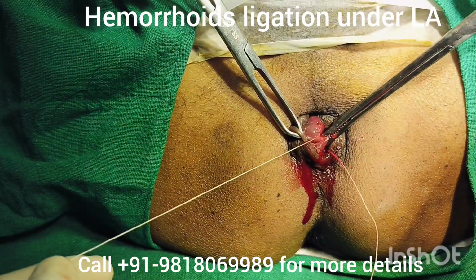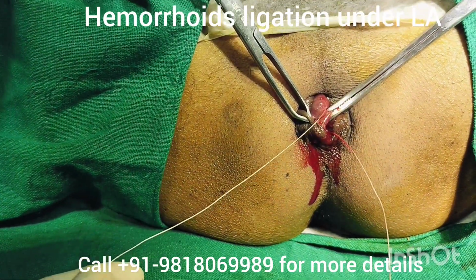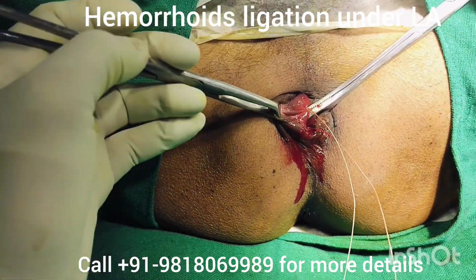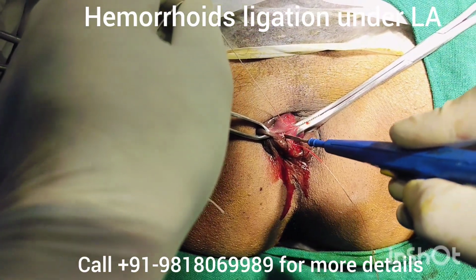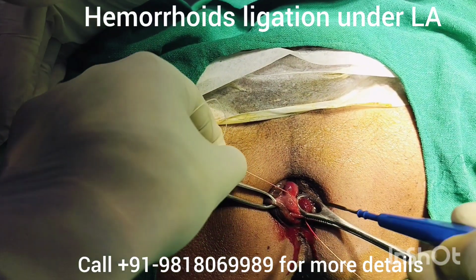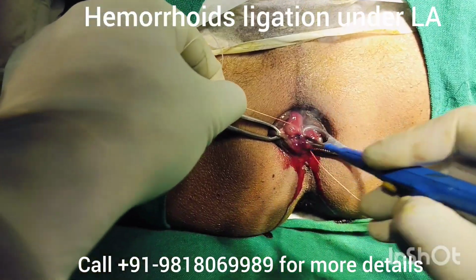Now second knot will be placed, but before that we shall separate the mucosa from skin, and I have used cautery for this purpose, and I had not used cut mode. I have used coag mode of cautery. Then I will place my second knot laterally by making this groove.